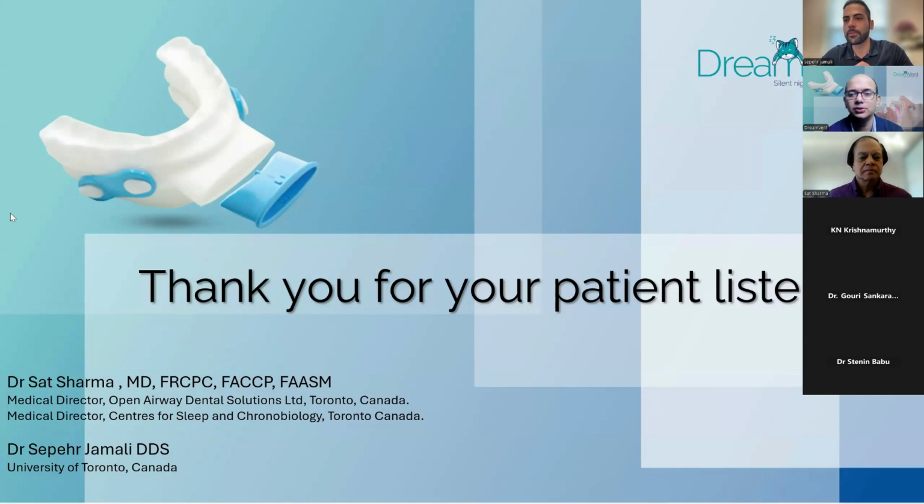I request the participants to post their questions if they have any, and we'll be sharing the FAQs and these videos with you regarding how to go about taking the bite. You don't need an intraoral scan all the time. You can also use a regular registration, but you should make sure. Yeah, you can take it with an intraoral scanner. The scanner will detect the upper and lower, and you will get the bite.